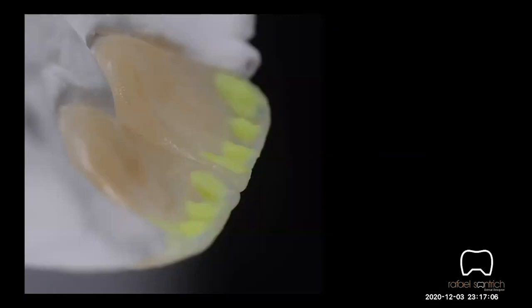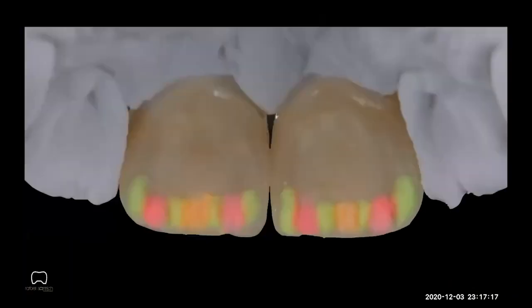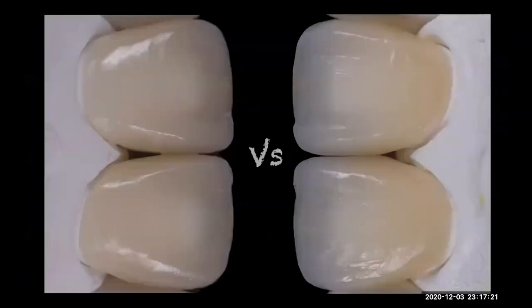Okay. We can create some translucency with clear, and then we cover everything with enamels. So we need to do the same build that we do from buccal, but from palatal. Okay. This is step by step what we do. That's the result of the two restorations.